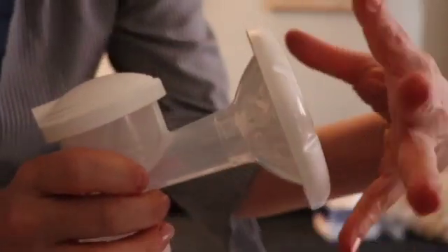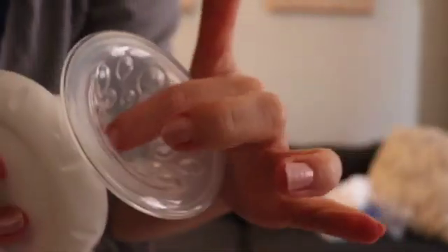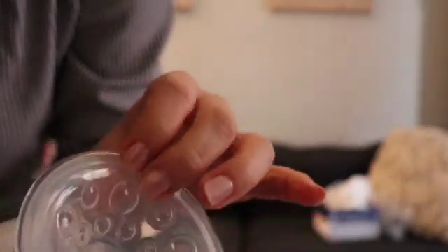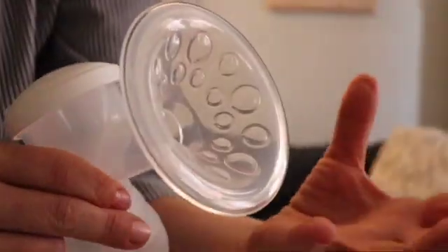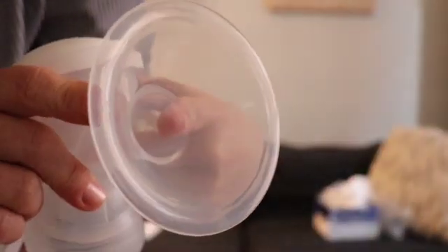I'm gonna also keep this up close to show you that the flanges both come with a set of covers and that they have this soft, squishy cushion inside. This cushion can often help if you're kind of between sizes for a flange. It can help the flange fit you better, a little more snugly. It also causes a little bit more traction on the breast tissue itself, and these little bubbles can help cause a little bit more squeeze of the tissue behind the nipple to extract more milk. If you don't need this, it's also removable, so we can pull that right off and you can pump directly into the hard plastic part of the flange.